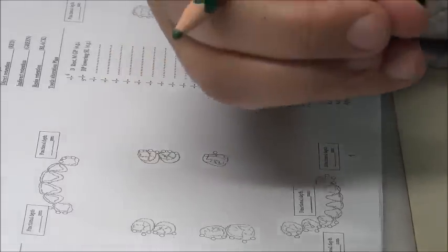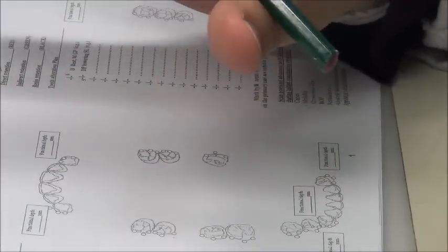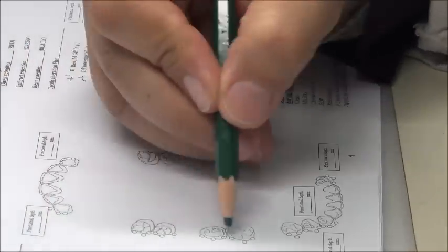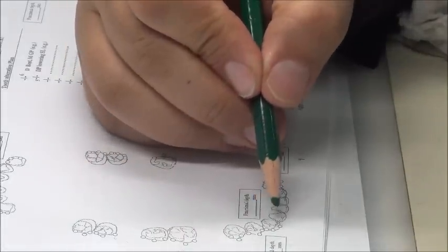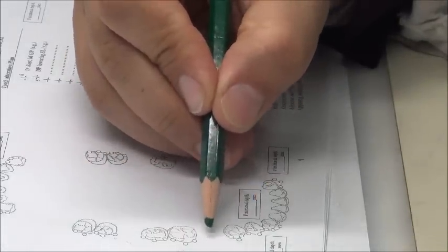The basic design for any bounded saddle contains an Akers clasp here, an Akers clasp here, and an area for resin.